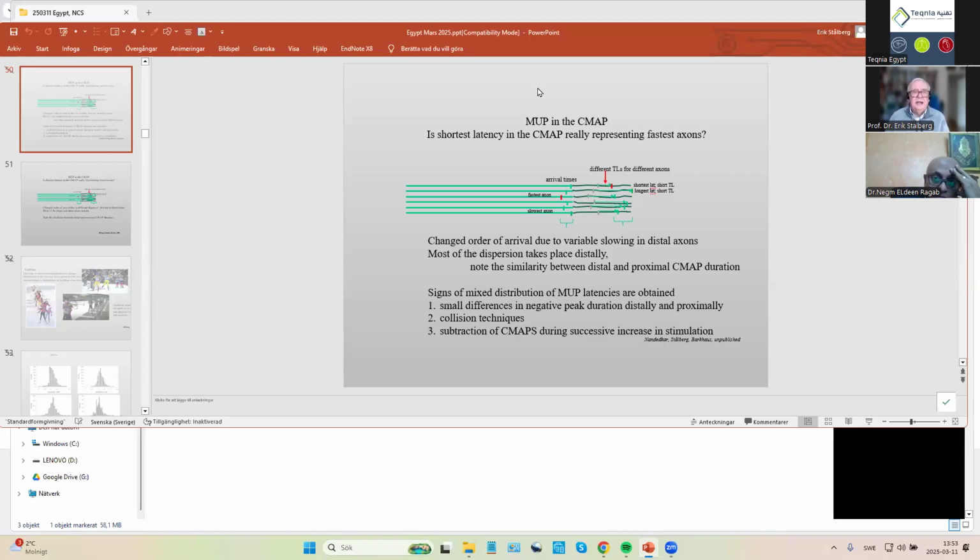We can say that there is a continuity of the nerve. There is some conduction. And now with this operation, you can see the conduction much better. We can make a lot of good things with just studying below and above a problem, and many other things also. But this was one example.